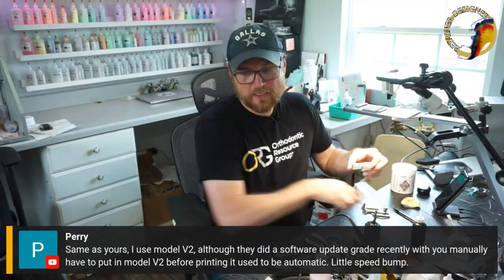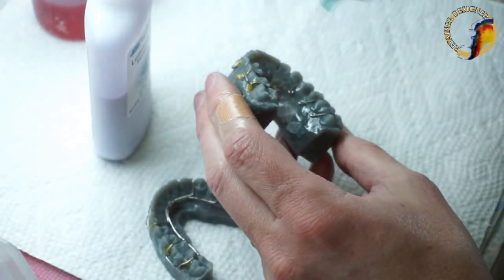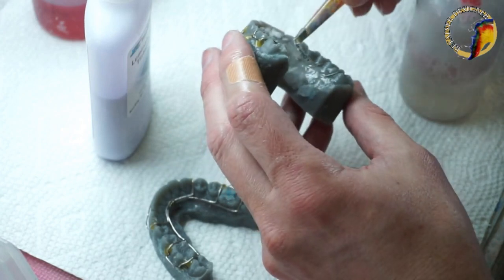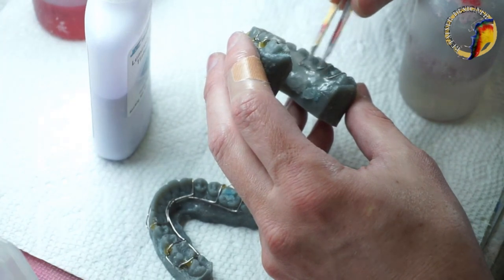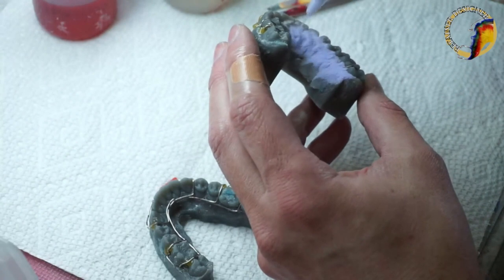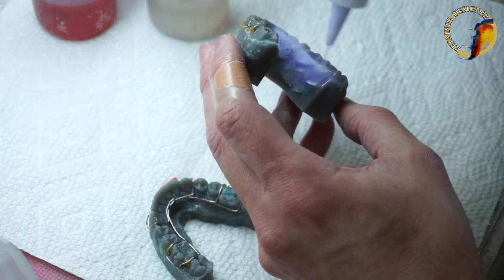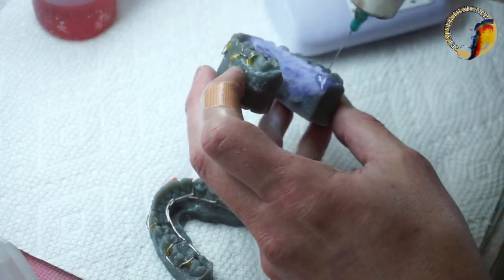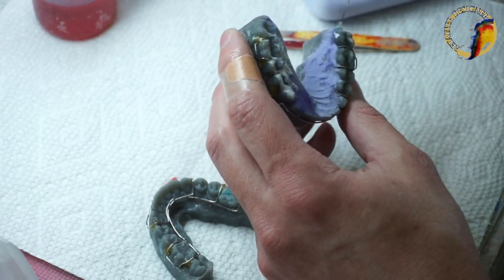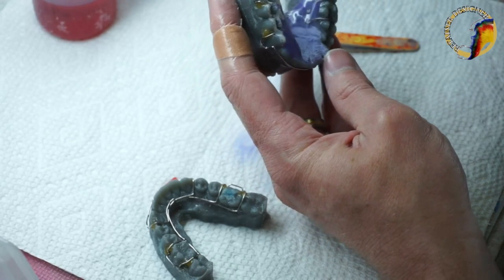They want to switch to luminary blueberry, so that's what we're going to use. I always put a clear coat of acrylic down first — that serves two purposes. One, I like to put the name on the tissue side so you don't have to worry about the thickness of the acrylic, it's always visible. Two, you can also see the wire. If you use a very opaque color and go to trim it, you can't see your wire — you'll definitely hit it with your grinding wheel. Then I'll put a clear coat on top as well.